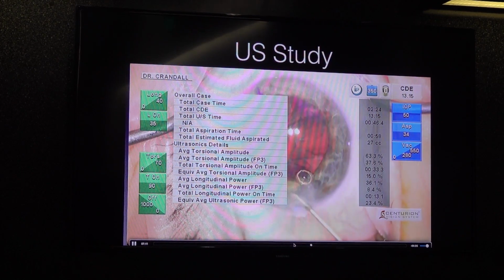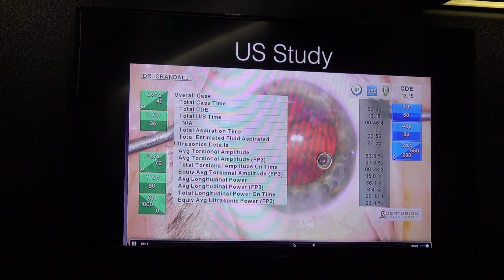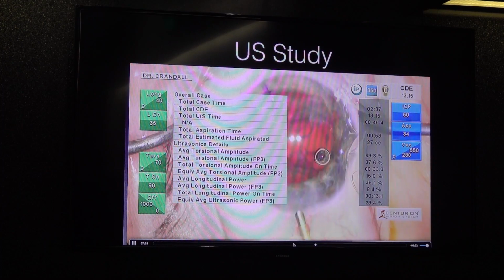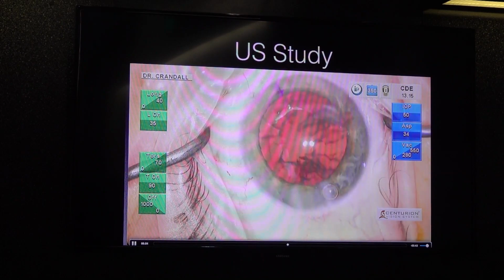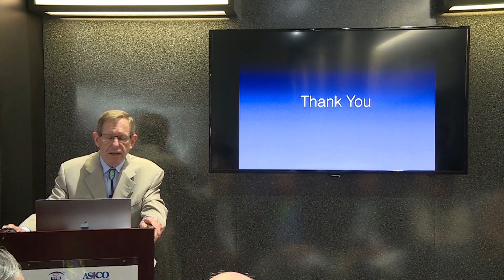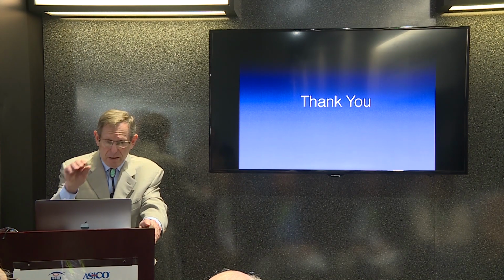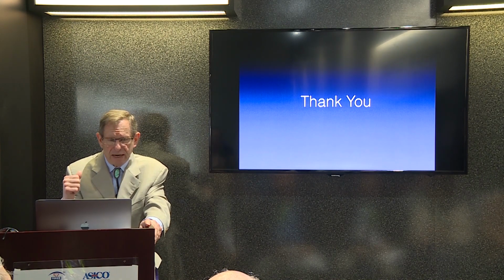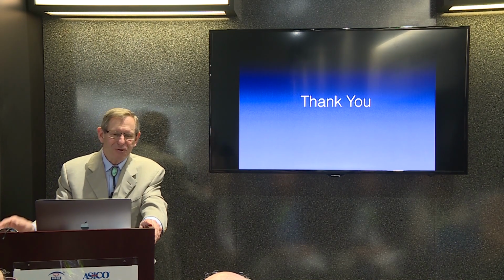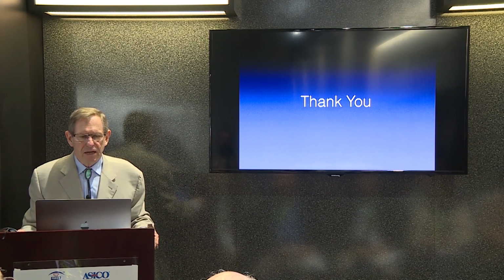What size side port incision do you use? I use a one. It depends on what your second instrument is. Some of them are a little bigger. So it's just a matter of what works well for you. With the Centurion, you use a 2.4? 2.2. At the private hospital it's 2.2, 2.4. So once you reach the internal, it's 2.2 and the external is 2.4. Actually, what you'd really want is the opposite. You'd like to have it 2.2 externally and then 2.4 internally, so your internal manipulations are easier. So I use a 2.2, and then I widen those a little bit depending on the strength of the lens.